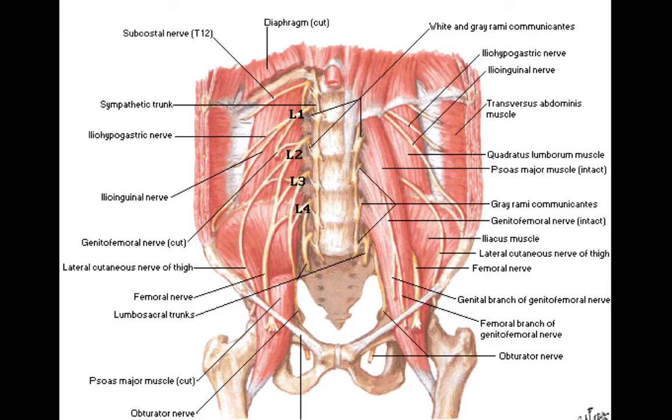Now, the femoral nerve is very easy to find with nerve stimulator and can be frustratingly difficult to find with an ultrasound probe and needle. So just a quick reminder, obviously it comes off the lumbar plexus, with L2-3 or L2-3-4 components. It sits on the iliacus muscle and the psoas muscle, which together inferiorly form the iliopsoas muscle, and runs underneath the inguinal ligament before proceeding to the thigh.